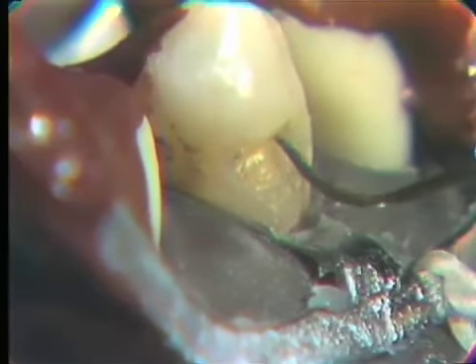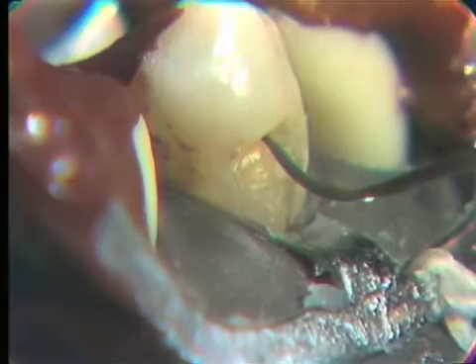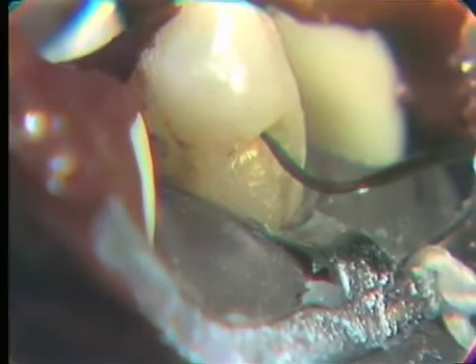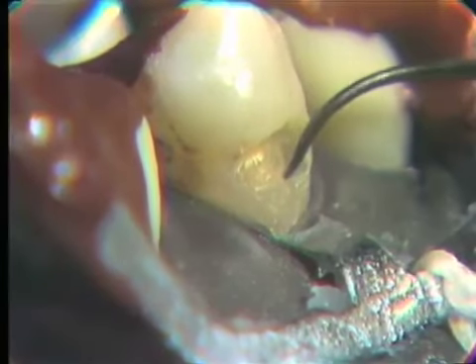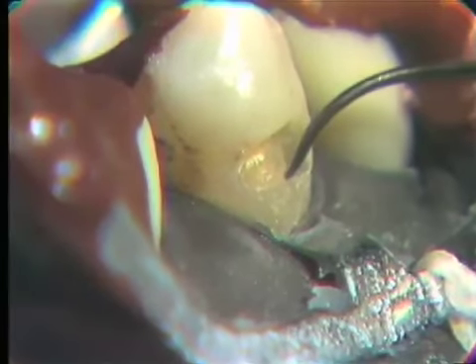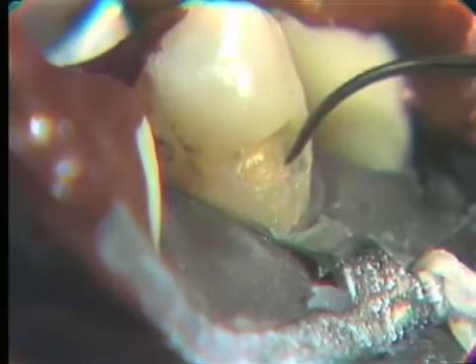Note also that we've established a point of retention at the occlusal portion of the decayed area at the normal depth for our primary mixed consistency cement, and at the cervical to give a locking effect for the secondary consistency that we will place in this area to restore the normal form of the cavity preparation.